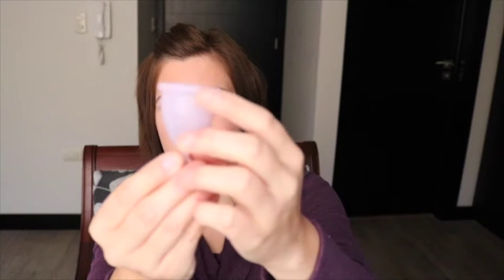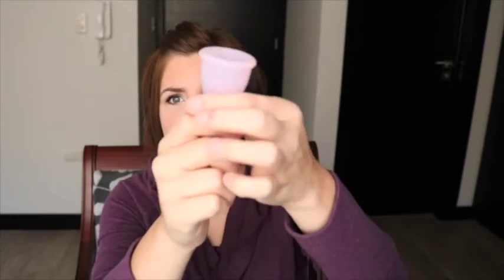If you can see here, this product has a kind of thick rim and it also comes with this long stem right here. This stem is supposed to be used to pull the cup out after your period so you can dump it. I had to cut my size large almost all the way off for my body.